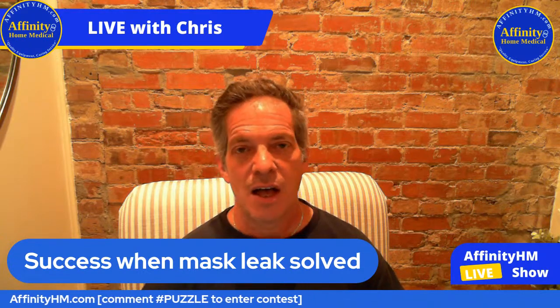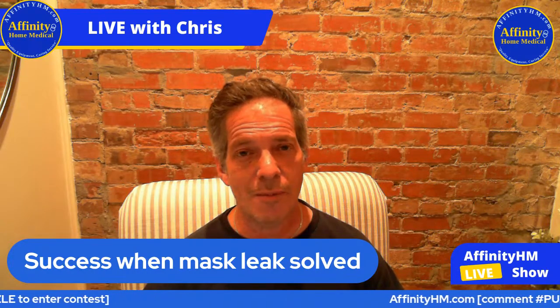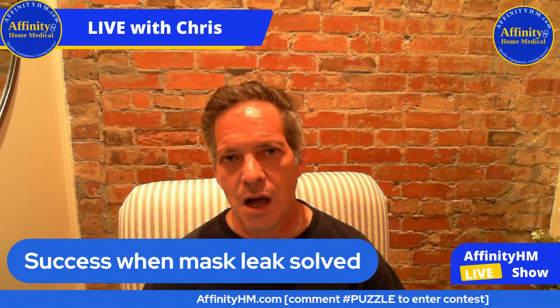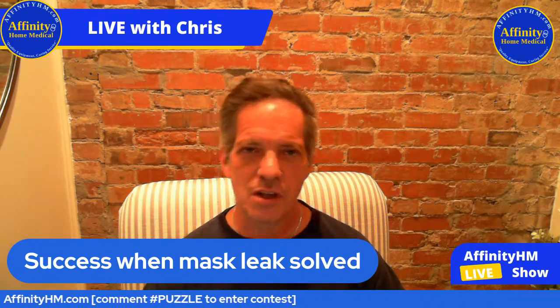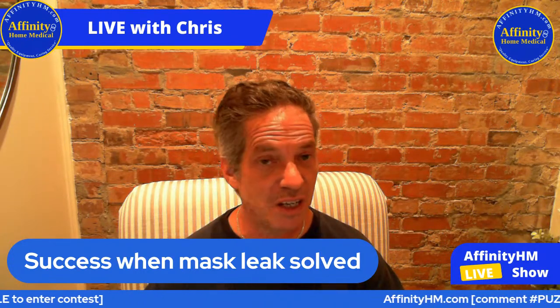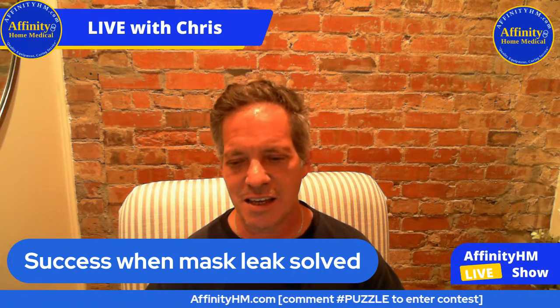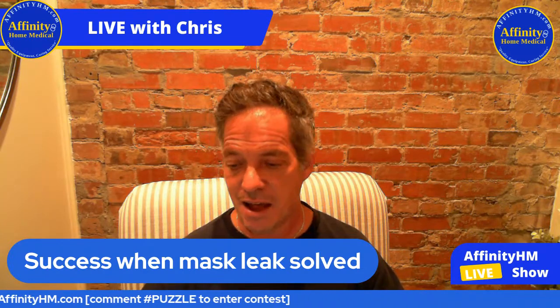I have an opinion. My opinion is that the full face mask is probably best for most people, as long as you can tolerate having that mask. If you're a side sleeper, sometimes a full face mask can be a problem. You lie over on your side and the pillow pushes the mask out of position, causing a leak, which can be a problem. But then you can get a CPAP pillow that will take care of that.